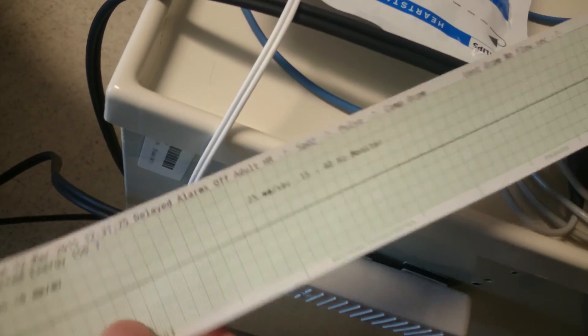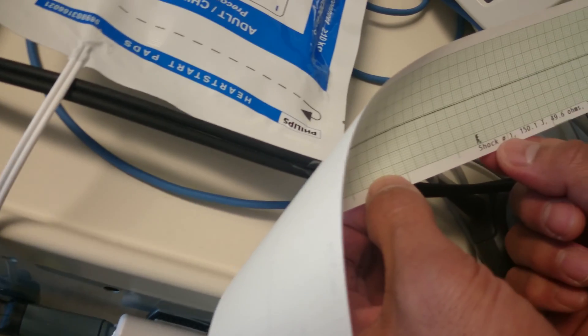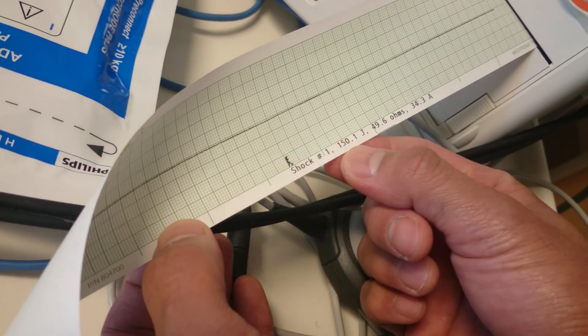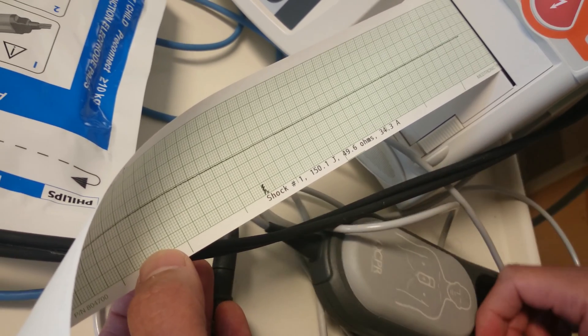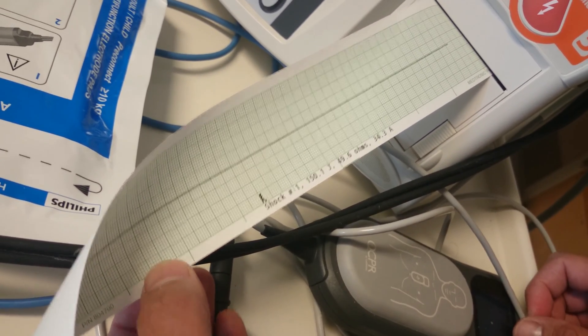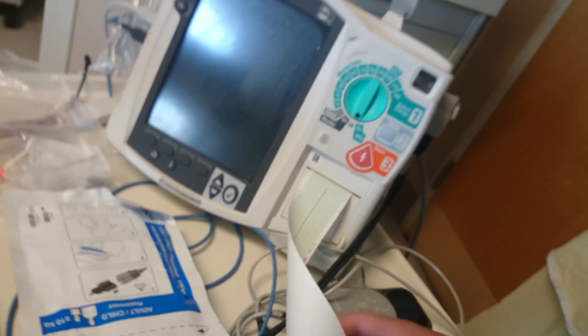Then turn it off. If you did the test right, it'll show shock number one with the joules output. If you're a charge nurse or resource, you always log that in. That concludes our tutorial.